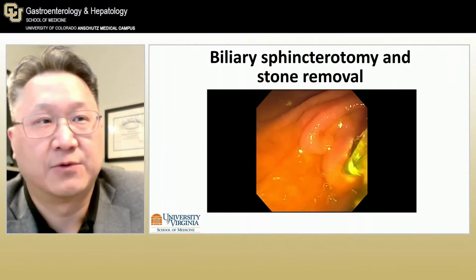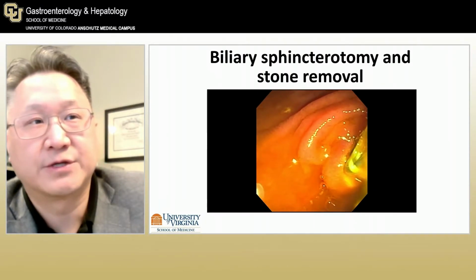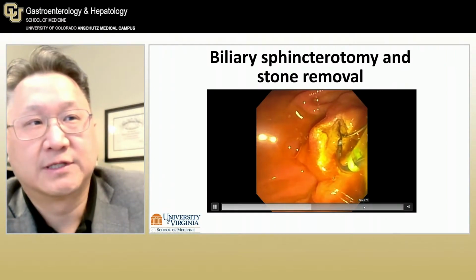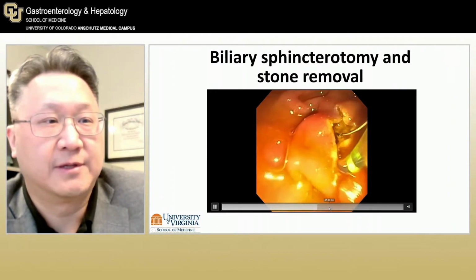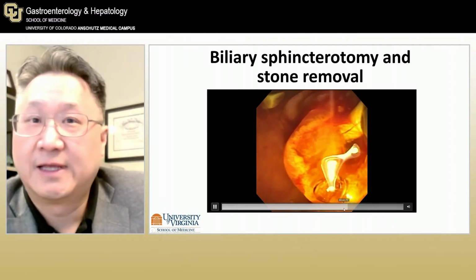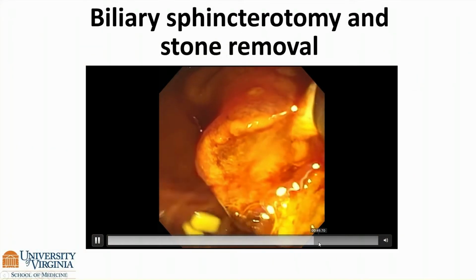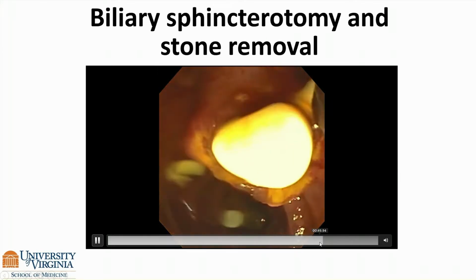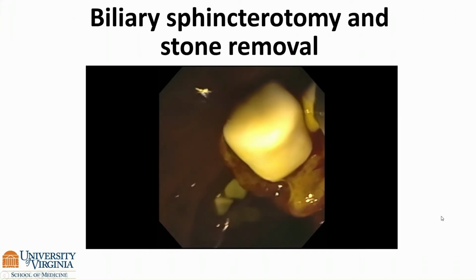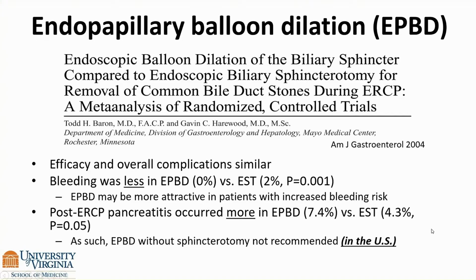So we're approaching the lateral duodenal fold. I usually cut and then reorient and make sure we're going in the direction you want to go. See normal exposed ampullary and biliary epithelium. And then we switch to a retrieval balloon and very easily are able to remove several stones, including here, I think this is the largest one. So very easy. I think it's within the armamentarium of anyone who does conventional ERCP.